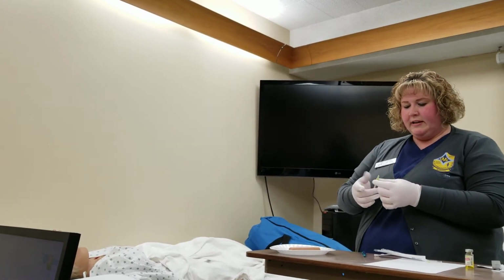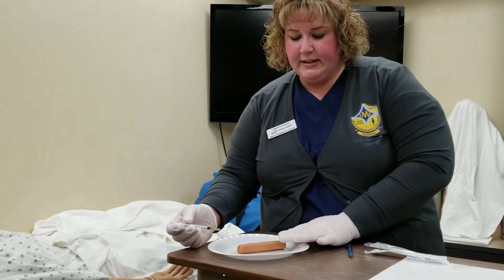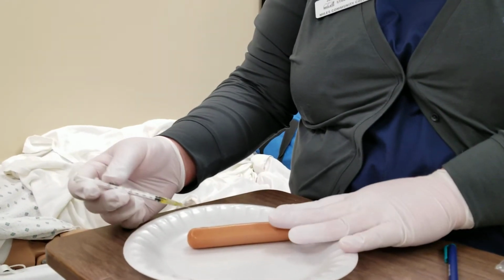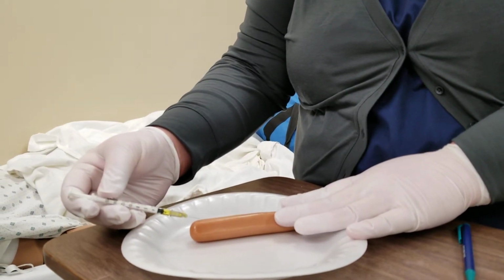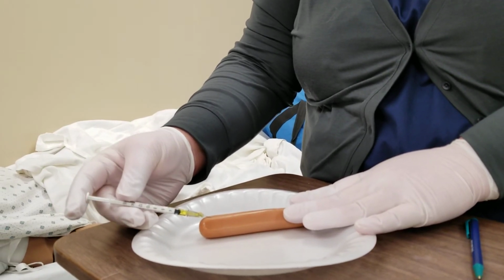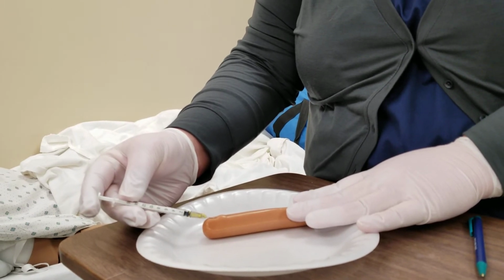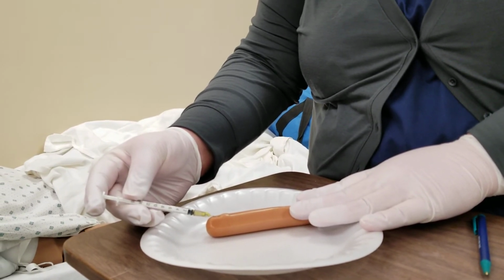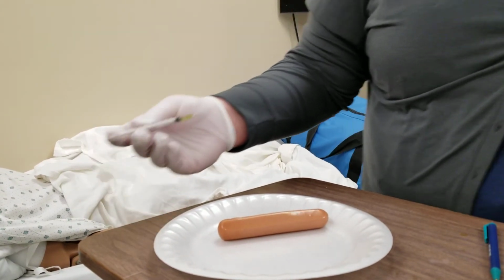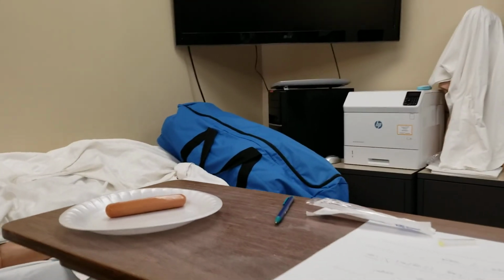Then we are going to take our syringe, and we are going to inject it while holding the skin firm at a 5 to 15 degree angle with the bevel up. We are going to inject the medication, and a wheal will form, and then we are going to put the needle directly into the sharps container.